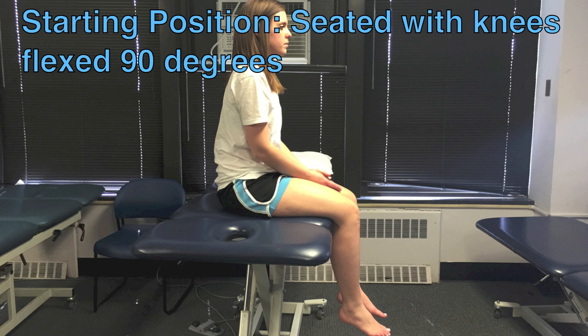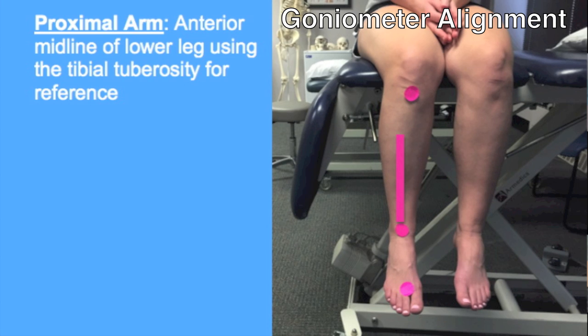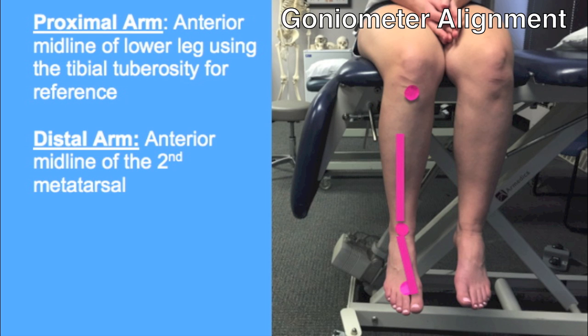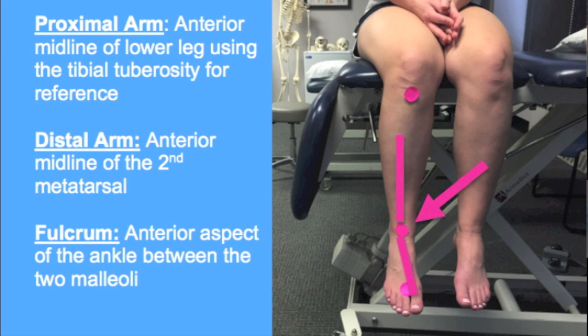The patient is seated with knees flexed to 90 degrees, with hips in 0 degrees of rotation and 0 degrees of abduction or adduction, and in subtalar neutral. The following goniometer alignment can be used to measure transverse tarsal inversion and eversion. The proximal arm should follow the anterior midline of the lower leg using the tibial tuberosity for reference. The distal arm should follow the anterior midline of the second metatarsal, and the fulcrum is the anterior aspect of the ankle between the two malleoli.